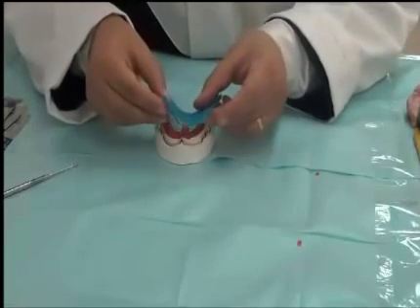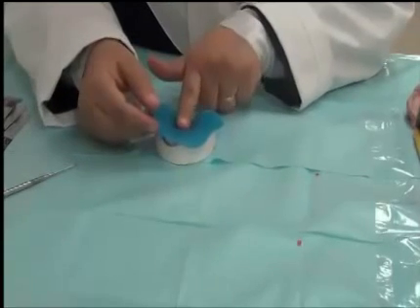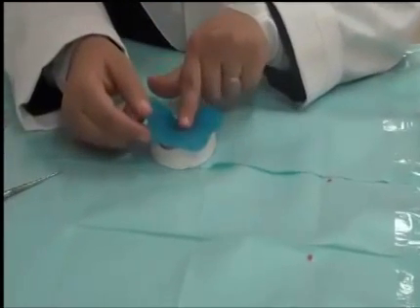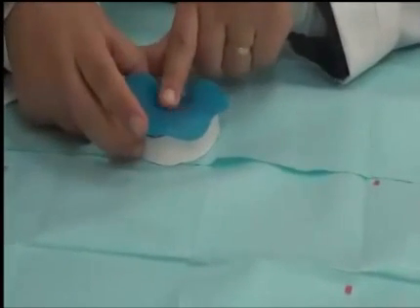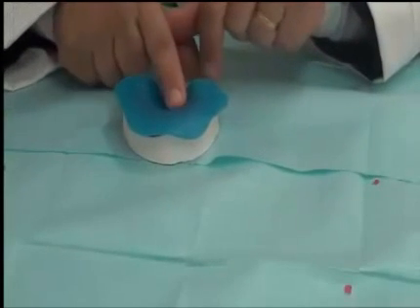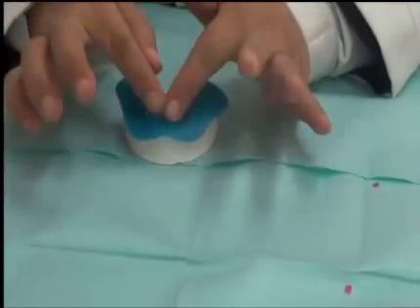So when we are going to do our steps, we concentrate that you, once more, adapt but not press or thin the material. So we're going to adapt the material with our fingers from the palate first, then over the crest of the ridge, we're simply removing any voids or any air trapped inside, and then we run from the crest downwards.